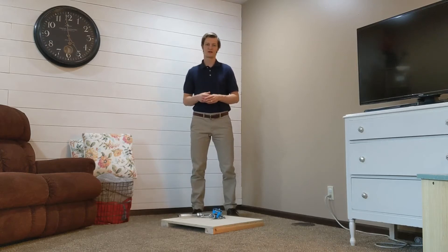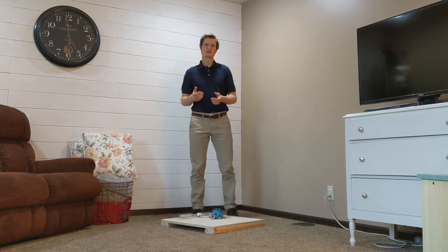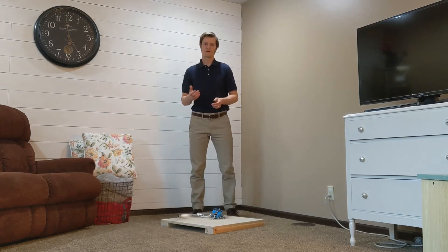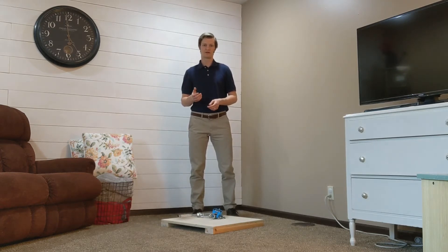A mid-thigh pull using a crane scale is a cheap and objective way to measure lower extremity strength in patients. This is especially helpful for clinicians treating patients in the home or in a facility with minimal equipment. I first heard about using a crane scale from JW Matheson and Eric Mera on their podcast PT Inquest.